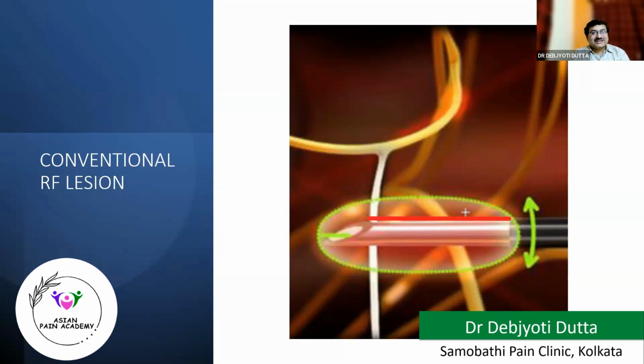Now, when it has reached 80 degrees Celsius, the tissue slightly away from it will be at a little lower temperature. Say it is at 70 degrees Celsius, because the heat is generated at this part and then transmitted here. Further away, say here, it is at 50 degrees Celsius. And in further distance, these tissues are at 45 degrees, and beyond that, all at 37 degrees Celsius.